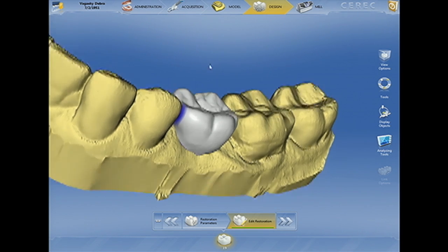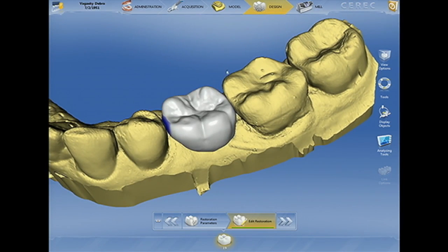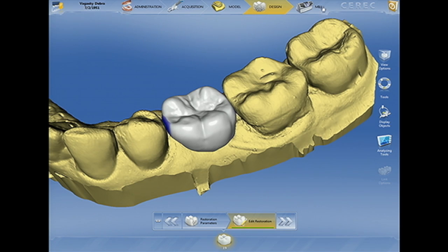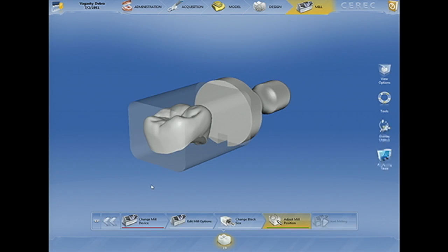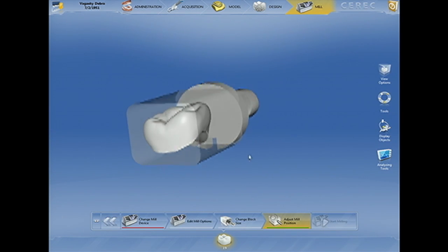Once we've designed a tooth in the CEREC environment, we actually have to get to the milling stage preview. And it's within the milling stage preview that we're able to export this file. What we really need to do is export this file as a .ssi file, which is the correct format so that we can import this restoration into the cone beam scan.